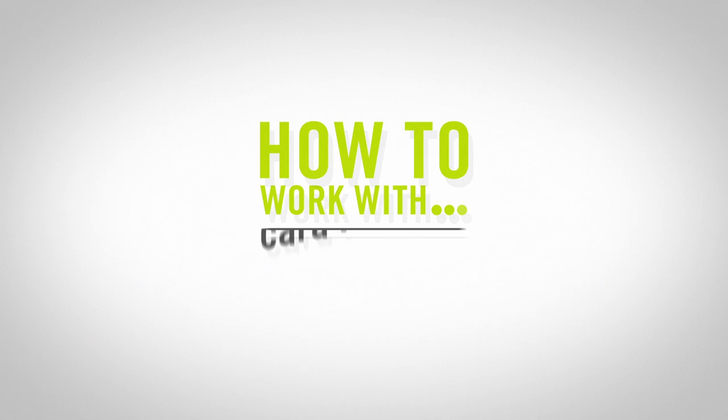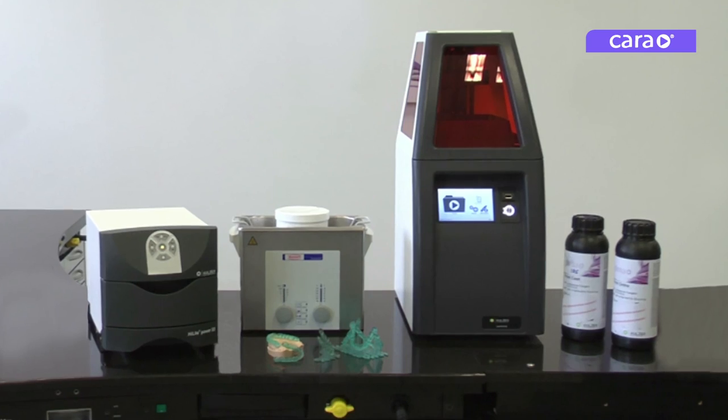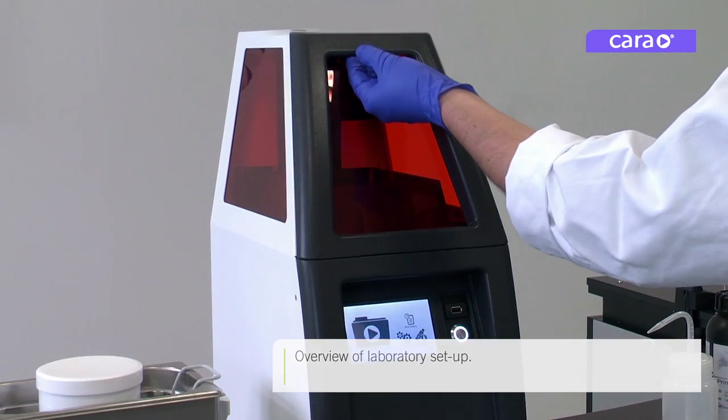How to work with CaraPrint 4.0. Before you start, make sure you have set up all your equipment according to the quick setup guide video or the instruction manual.